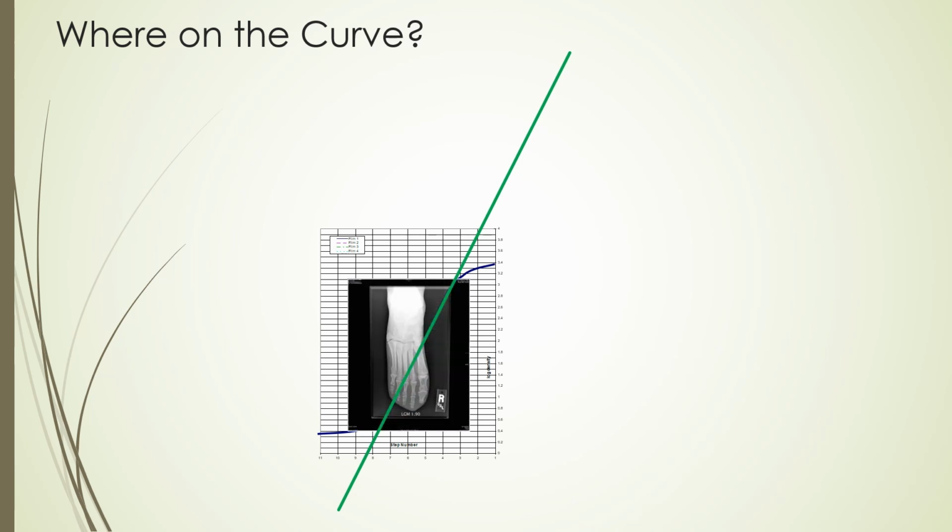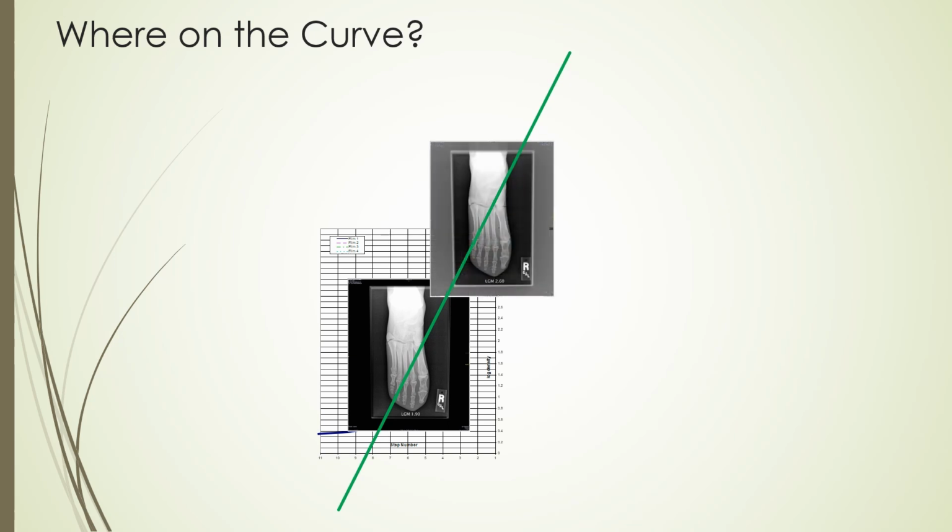The middle image appears at the confluence of the film screen and hypothetical curves. The image to the right is overexposed and appears slightly higher than the proper exposure on the curve. If it were a film screen exposure, it would be grossly overexposed, very dark and unreadable. But due to image correction algorithms used by the computer, it is made acceptable by shifting window width and level. There is enough contrast for the computer to distinguish the various structures.